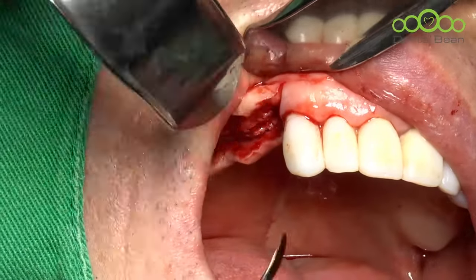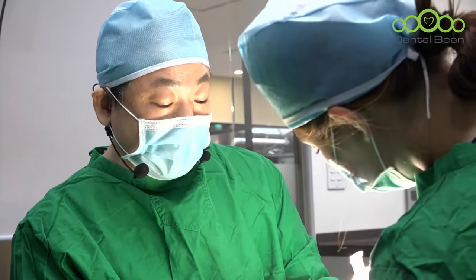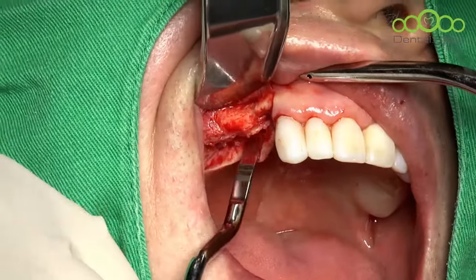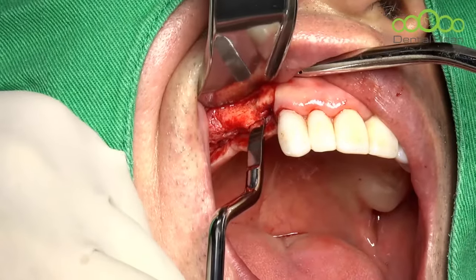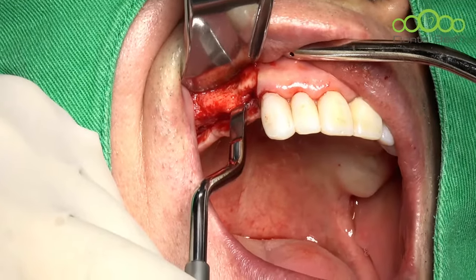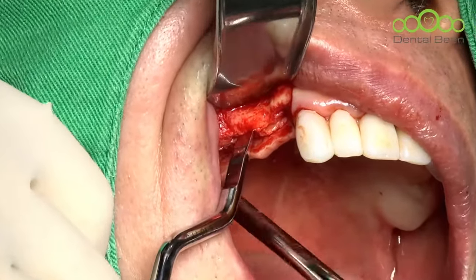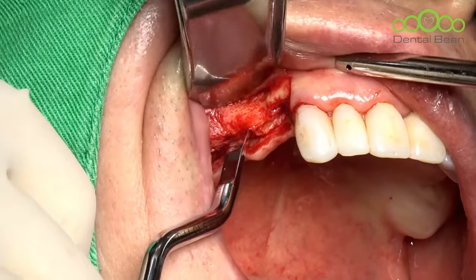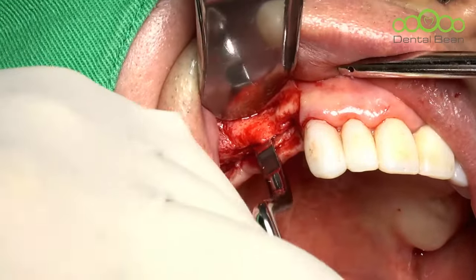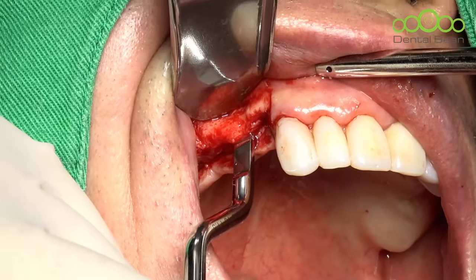So my favorite is a combination. Okay, using the Essa kit, I tried corticotomy. And I will combine a classical chisel to split the ridge. Although it is slightly inconvenient, I can really separate the ridge. Okay, under gentle malleting, I can split the ridge. The principle of using a chisel is do not shake buccolingually. Just insert and move mesiodistally. Then, by the thickness of the chisel, we can separate the ridge.